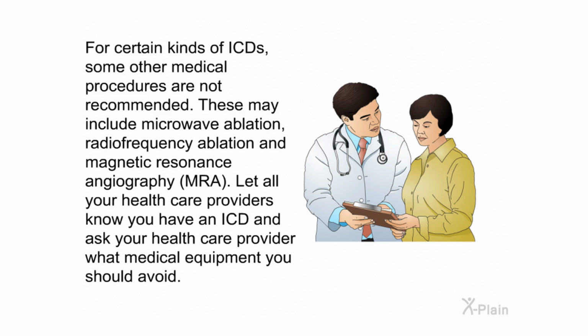For certain kinds of ICDs, some other medical procedures are not recommended. These may include microwave ablation, radiofrequency ablation, and magnetic resonance angiography, MRA. Let all your healthcare providers know you have an ICD and ask your healthcare provider what medical equipment you should avoid.